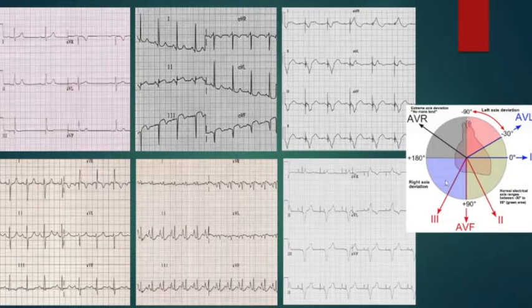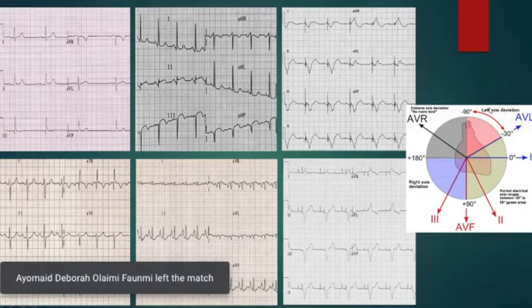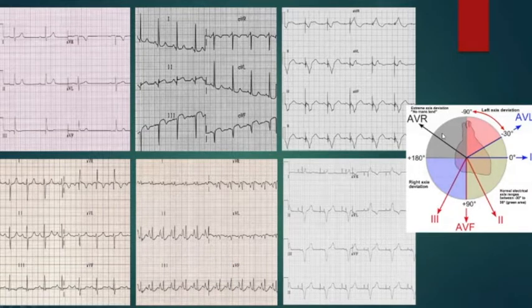But if we take the other lead, we have both of those leads positive, which are upper than minus 30 degrees. The AVR is around here, so the axis is around here, because they are both positive and lead AVL as well. Okay? Yes, ma'am.